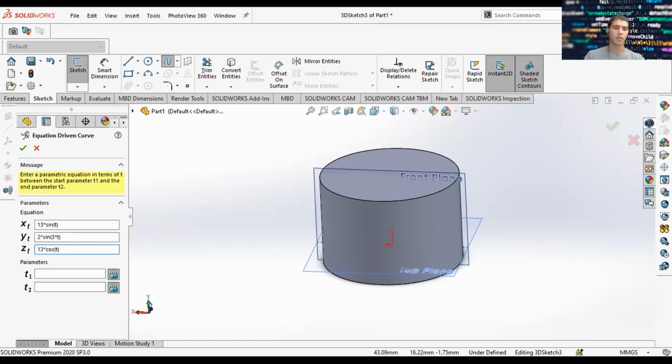And you want the last one to be cosine. For parameters, pi.